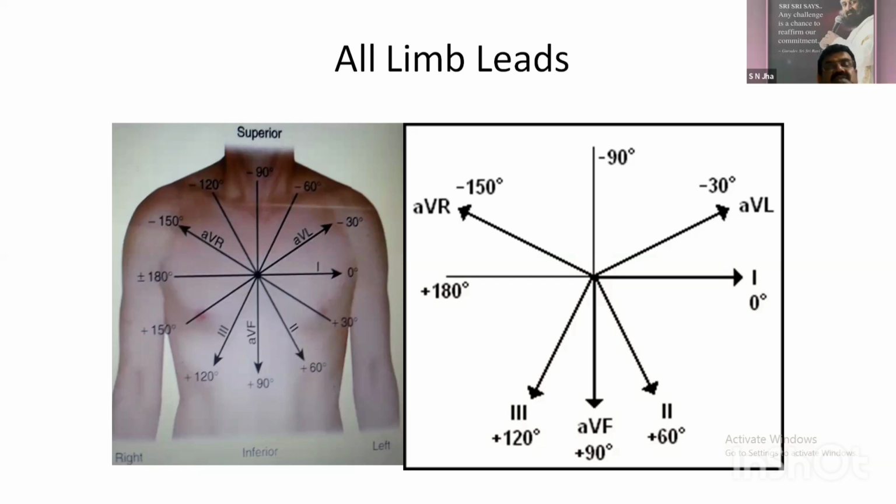If we see the ECGs, we can see that in the case of a normal heart, in AVR everything is downwards. Why is everything downwards? Because AVR looks at the heart from the opposite direction, totally opposite. So everything there will be negative deflection. The P wave will be negative, the QRS will be negative, the T wave will be negative, everything will be negative, because AVR looks at the heart from the back side. So these are the normal ECG axes.